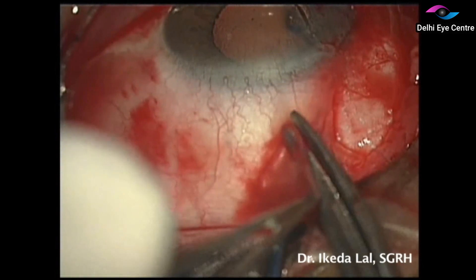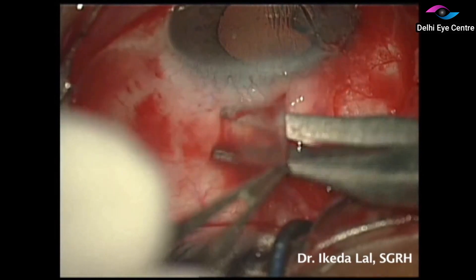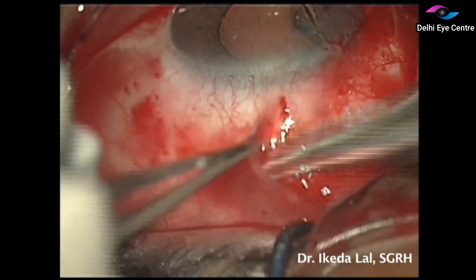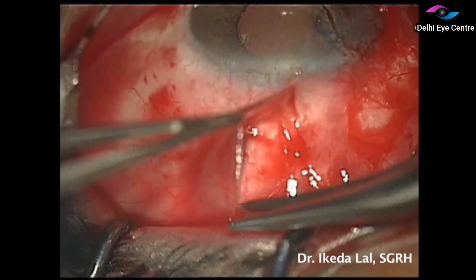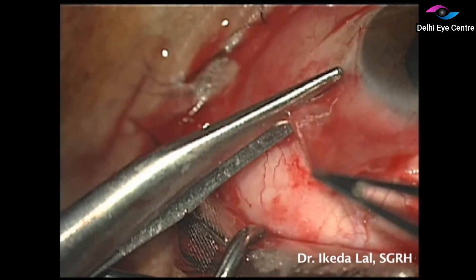The conjunctival autograft is taken from the superotemporal quadrant of the same eye. Here again we are using a blunt dissection technique to avoid buttonholing of the conjunctiva, ensuring a thin autograft with hardly any subconjunctival tissue — the thinner the better.